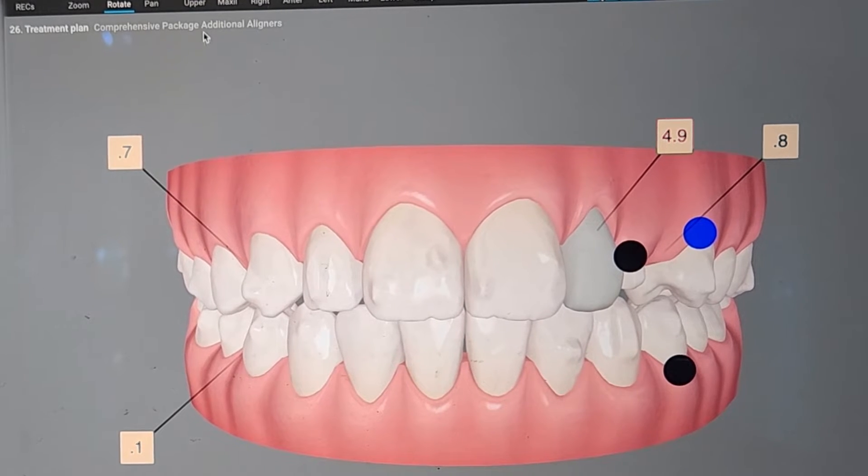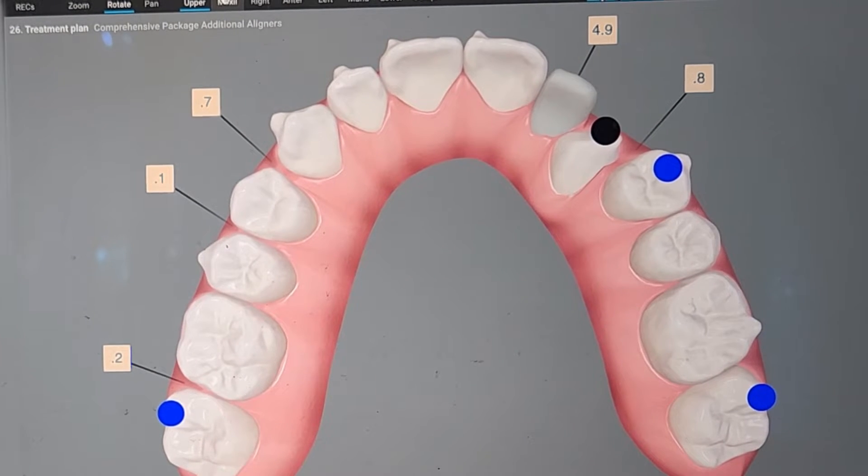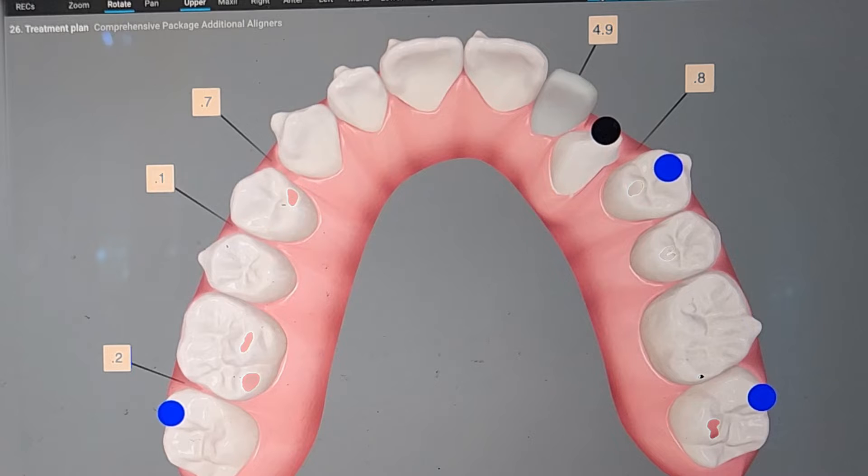Next thing I do as a very first step is go ahead and hit the maxill button right here. I'm gonna flip it over and check — push the occlus button, which hopefully has a green dot. And I'm gonna make sure the contacts are the way that I saw them either at the refinement or when I took the new set of records.